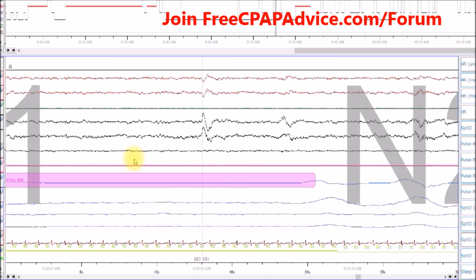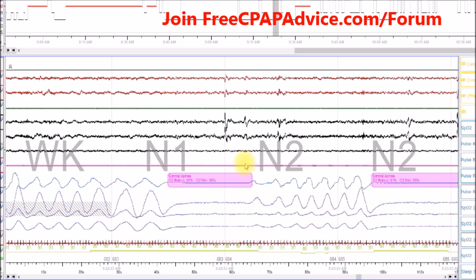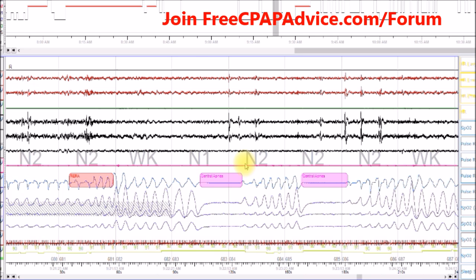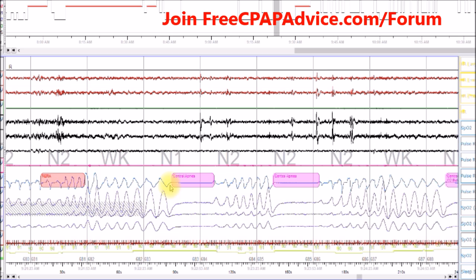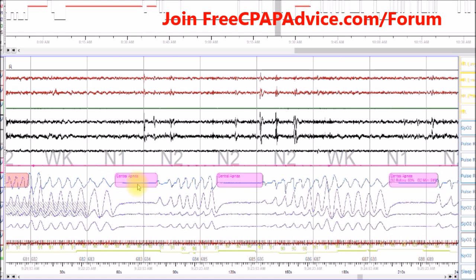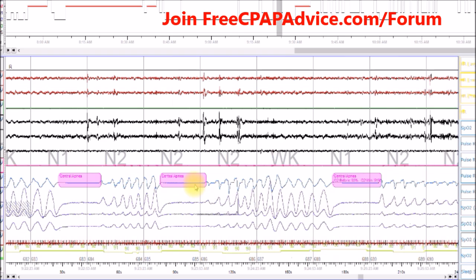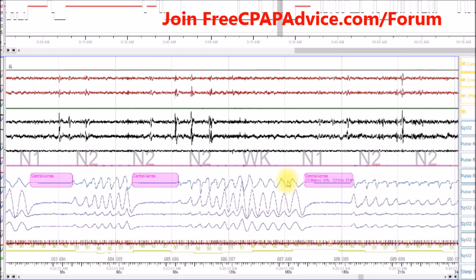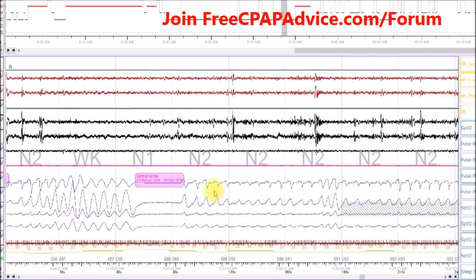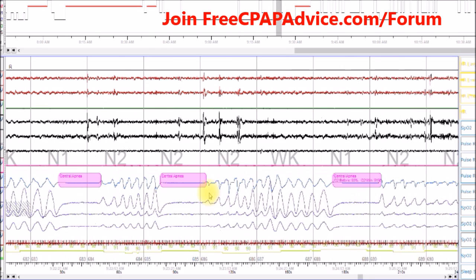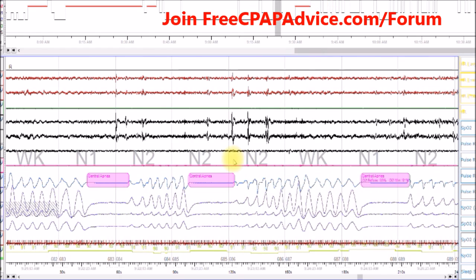Now here are real central sleep apneas. You can see in the sleep data that they're asleep here, stage one, then they move into stage two with this big K-complex. If you zoom out, you can see there are no spikes - they kind of slowly transition into it. It slowly gets bigger, then nothing, then slowly gets bigger again, then slowly goes down. When you see that big spike in front, that is most assuredly not a central apnea.